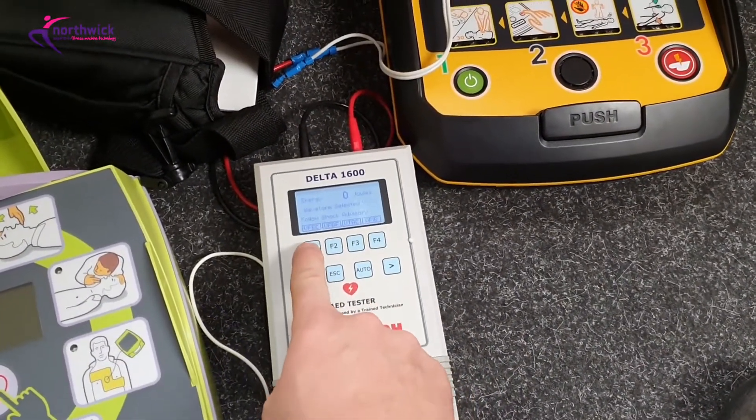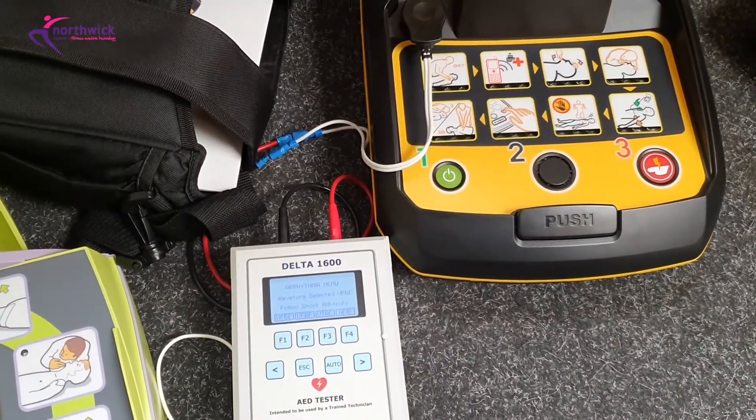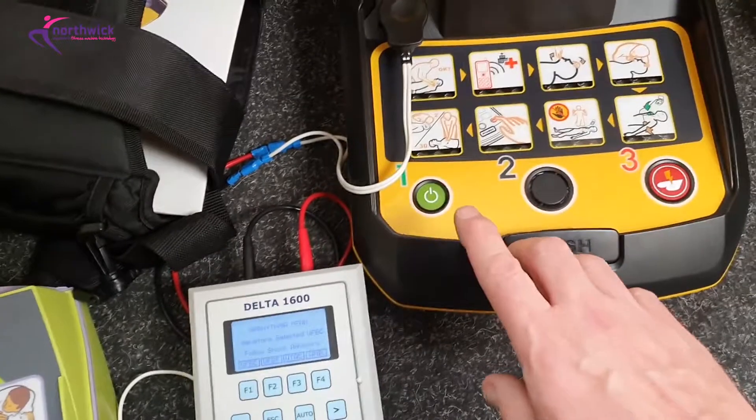As part of the testing, we connect it to an analyzer — this device here — and on here I can simulate an arrhythmia pattern which would require a shock. I've got that set up on the test kit.